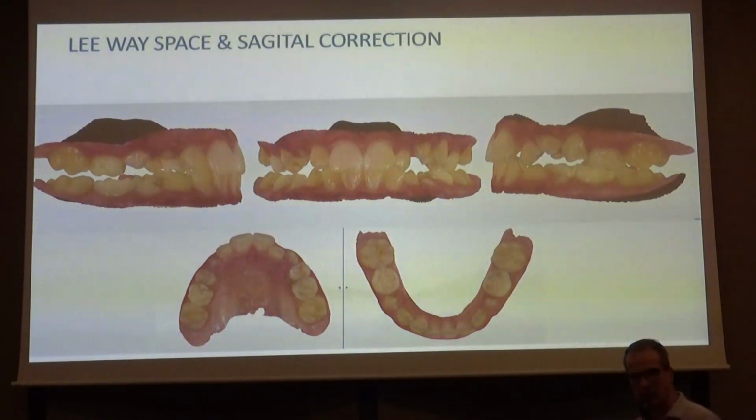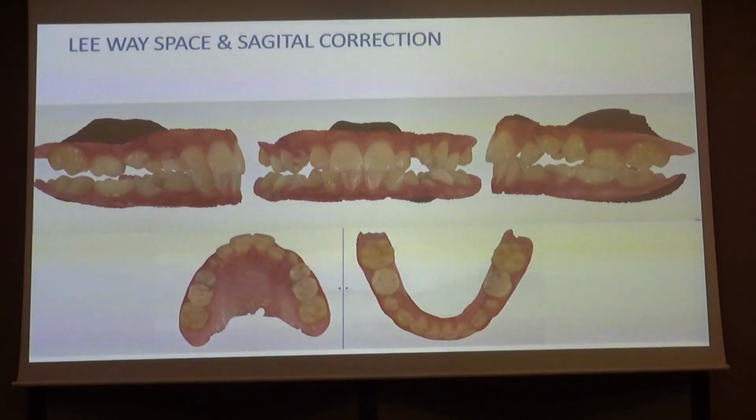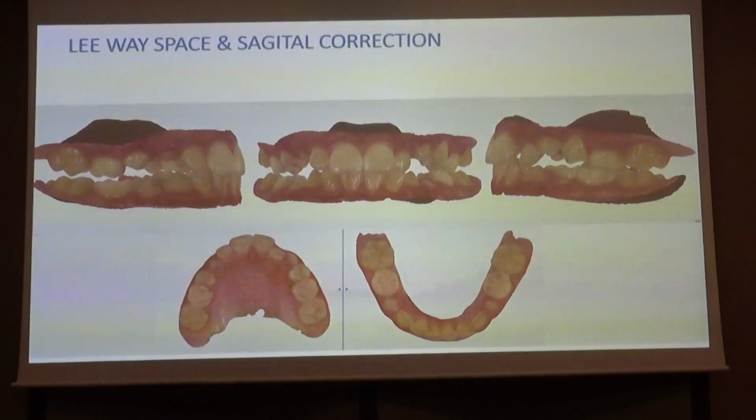More than this, we know that aligners struggle to do this root movement in the mesiodistal direction. So for this specific situation, this can be seen as a great advantage.